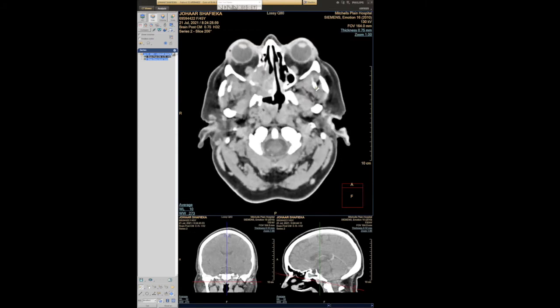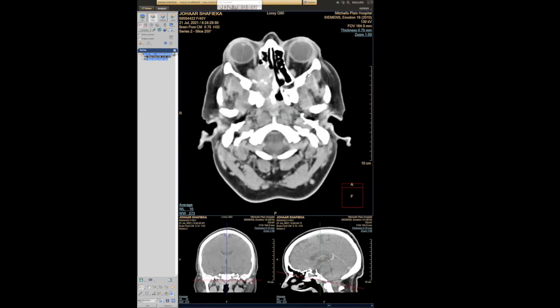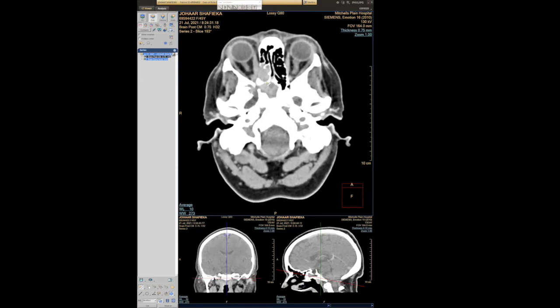Thanks. So the patient initially presented to Mitchell's Plain Hospital, where she had a post-contrast CT study. So just going to the area of concern, we can see that there's immediately this poorly heterogeneously enhancing mass centered in the pterygopalatine fossa, extending superiorly into the ethmoid sinus, as well as with intraorbital extension.